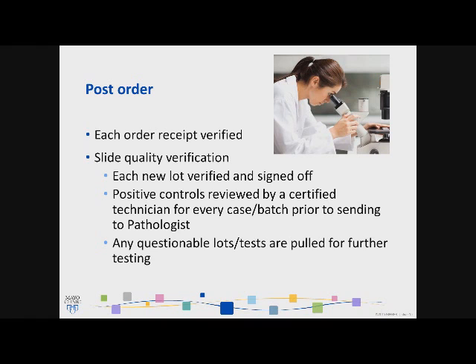All of our positive controls are also reviewed by a certified technician for every case. I know in different institutions they batch different immunostains, special stains, and the like. However, here we do put one control per slide. We found that that helps us to troubleshoot if there are issues.